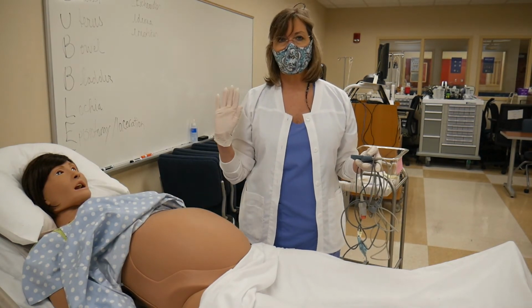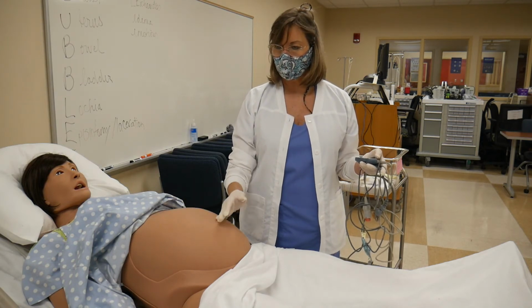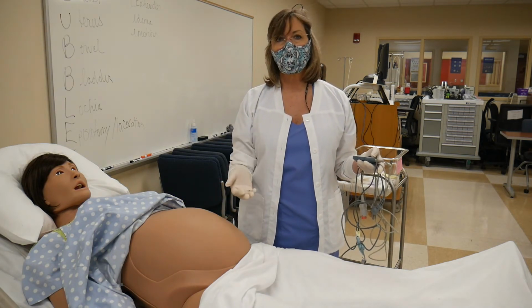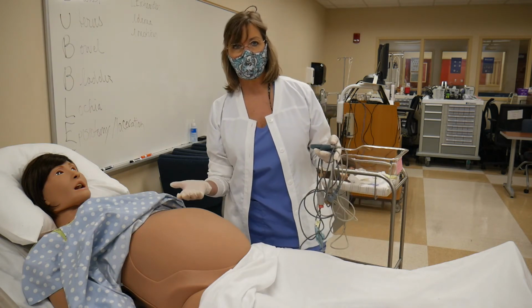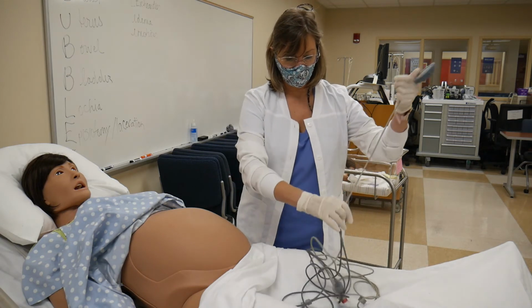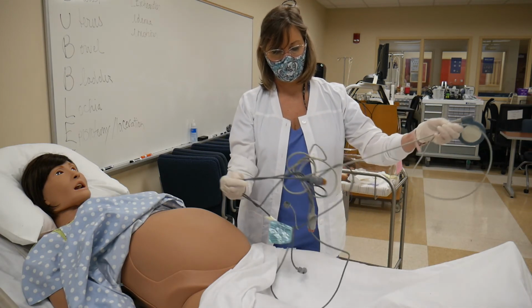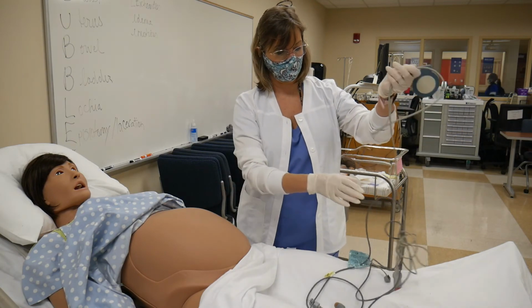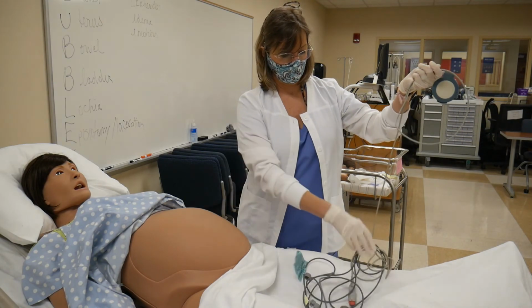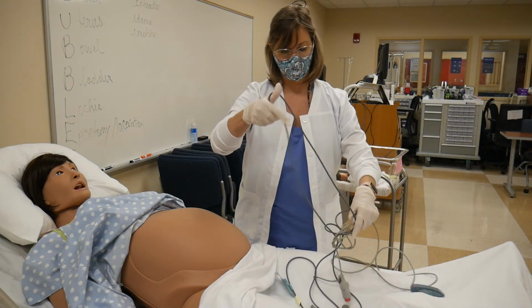We'll talk about the monitor strips in a little bit. But we also want to compare the baby's heartbeat with the contractions and see if the baby's having any kind of reaction to the contractions. And we'll go into more detail on that. So we have an ultrasound. And it's pretty common to have to untangle all this stuff. It's almost like earbuds. They seem to tangle themselves up.